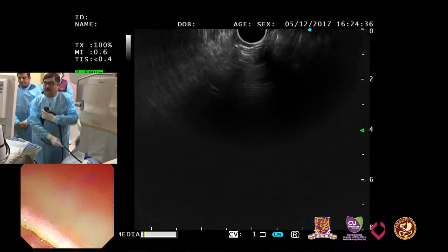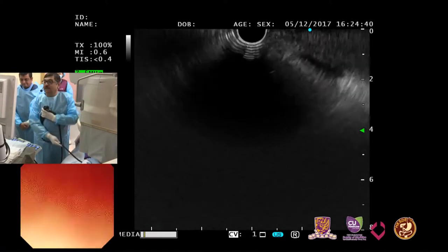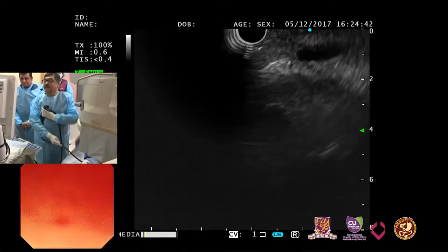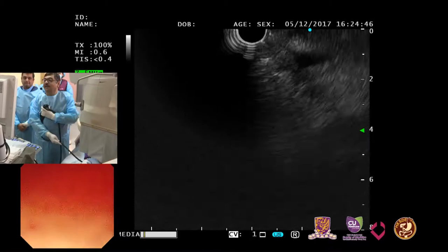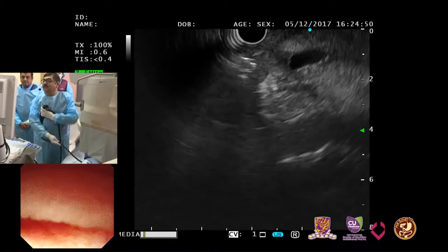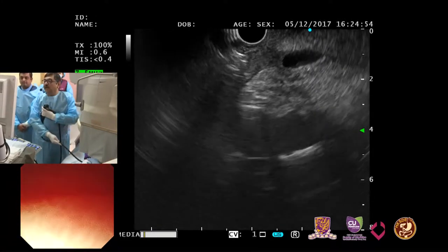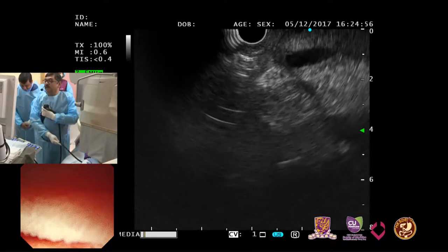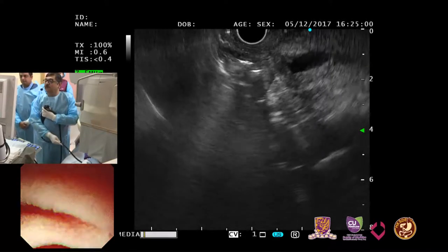Well, I think you should do ERCP and look at the low end. I think they said they had difficulty cannulating last time. I would not like to do an ERCP in a patient with a normal bilirubin and no indication on EUS that there is anything. I would do a side-viewing scopy to look at the papilla. That would be my approach.